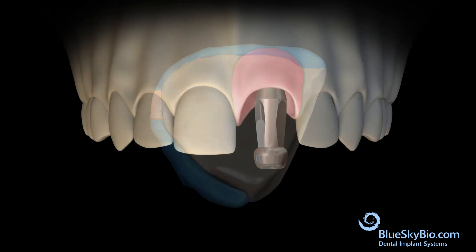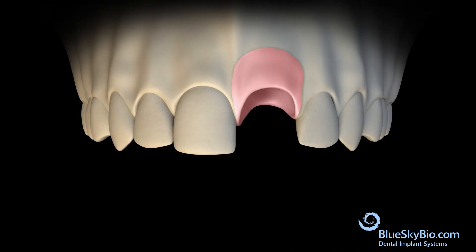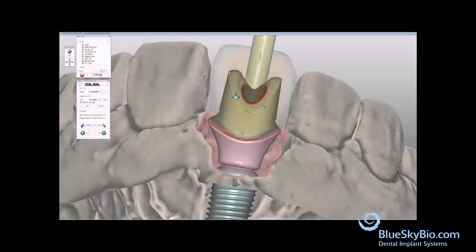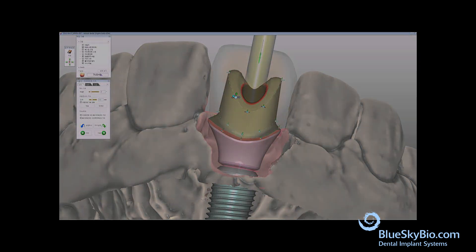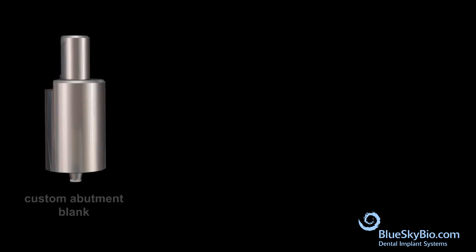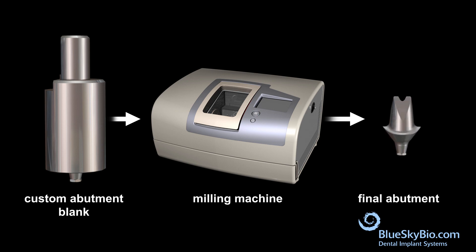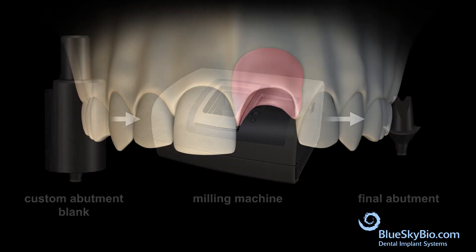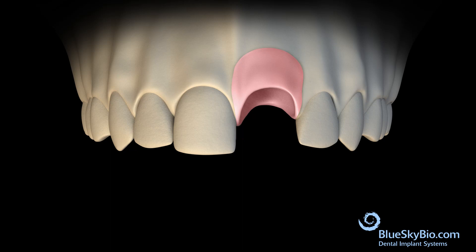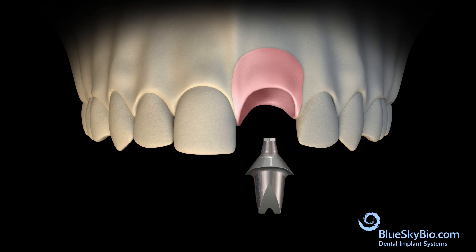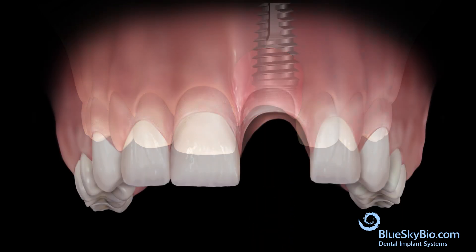Remove the impression transfer from the stone model. Design the abutment in a CAD software. Use a custom abutment blank to mill the final abutment. Place the abutment into the stone model to verify the fit. Remove the abutment and place in the mouth.